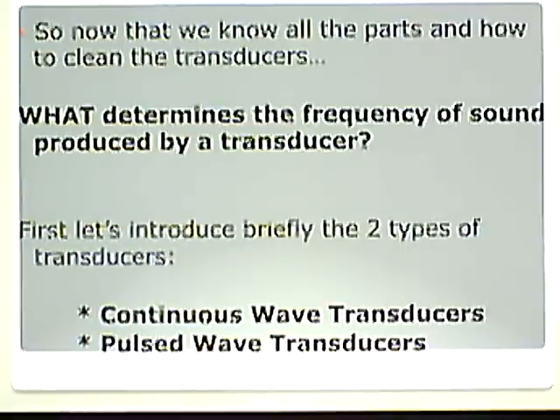So now that we know all the parts and how to clean the transducers, what determines the frequency of sound produced by a transducer? We learned how they're made. We learned about PZT crystals and the parts of the transducer. We learned all this good stuff. Taking it a step further, we want to know what determines the frequency of sound produced by a transducer.